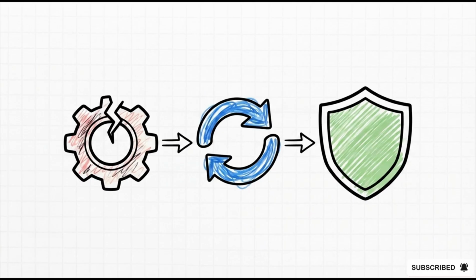Managing this requires the mindset of a true expert. Awake intubation should never ever turn into a battle of persistence. The safest airway operator isn't the person who stubbornly pushes through when things get rough. It's the person who recognizes when the primary plan is failing, maybe oxygenation is dropping or the patient is distressed, and stops to pivot early. You pause, you reassess, and you move immediately to Plan B or Plan C.